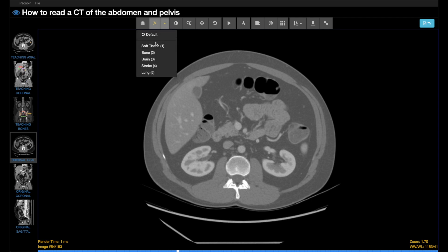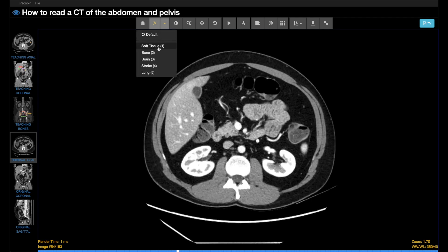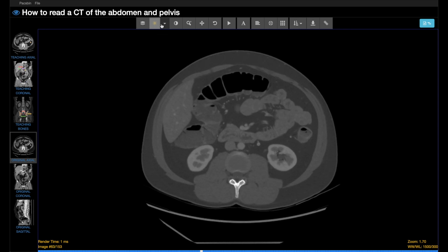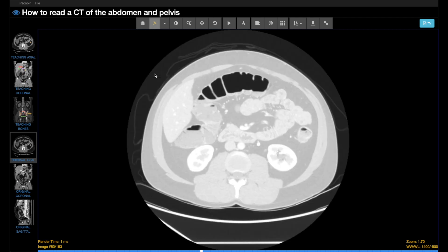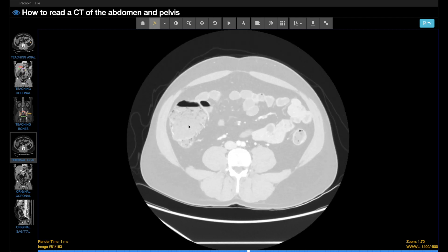There are often selectable default window level settings — soft tissue, bone, and lung — so it doesn't always have to be done manually, but it is handy to be familiar with how to do that.